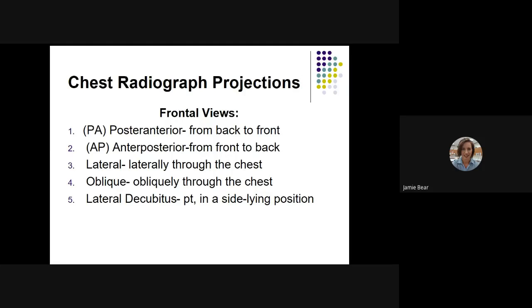So patients in the intensive care unit, the ones we would see a lot of times that are intubated, this is where the X-ray technician would come up to the patient's bed, put the film itself under the patient, and it would go from the front to the back. Okay, so PA and AP are different. If you're mobile, you would do the PA and lateral, which is the most common, but AP is what we tend to see a lot in the intensive care unit for patients that are immobile.